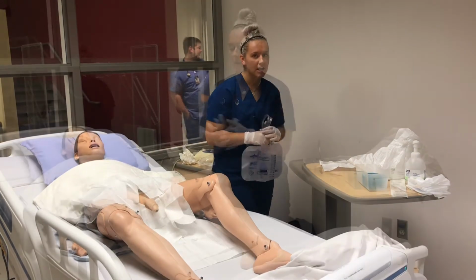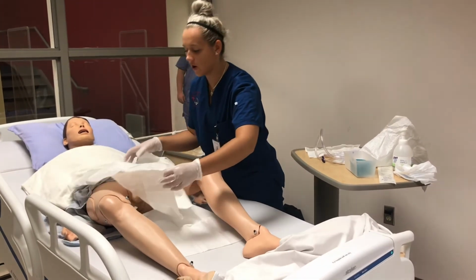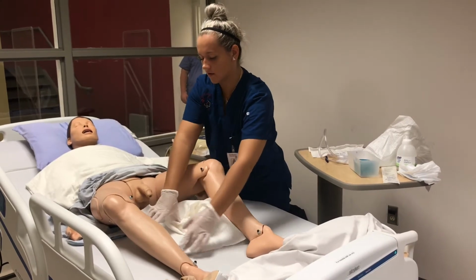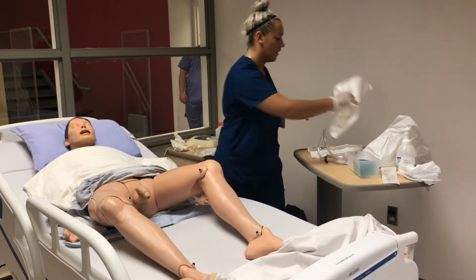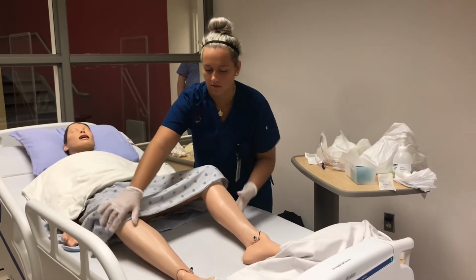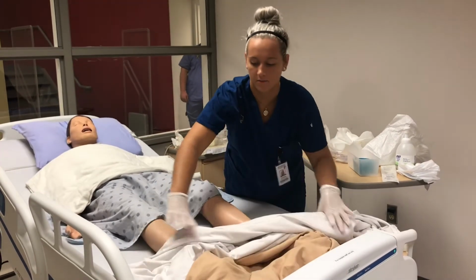Okay, so now I'm going to be taking off these drapes and also discarding them in the proper bin, which would be the garbage. And then I would just re-drape and pull the blanket up.